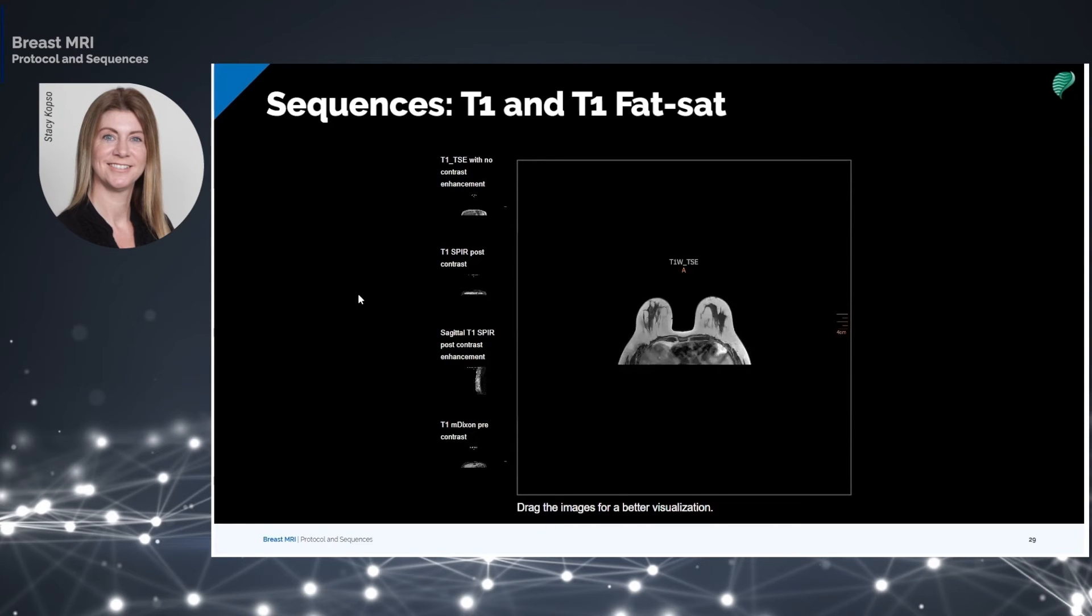T1-weighted imaging is performed with or without fat suppression, as well as before and after contrast media administration. T1-weighted images are useful for evaluating enhanced areas. T1 fat suppressed images are also done in the sagittal orientation.